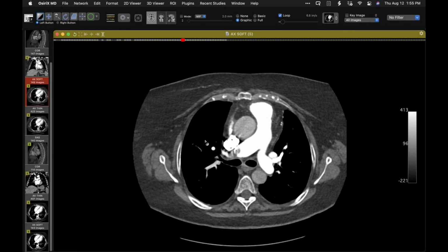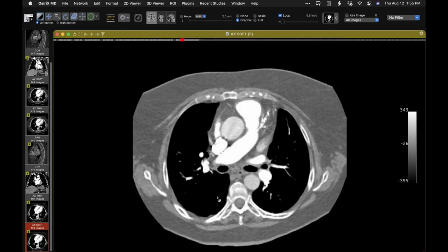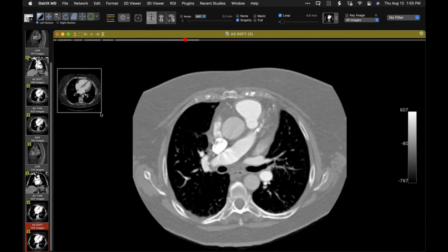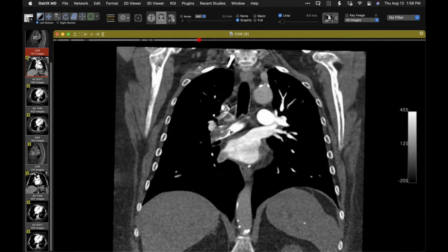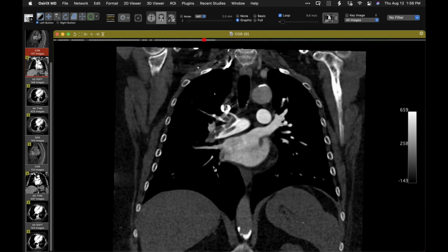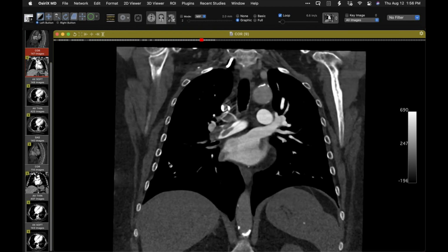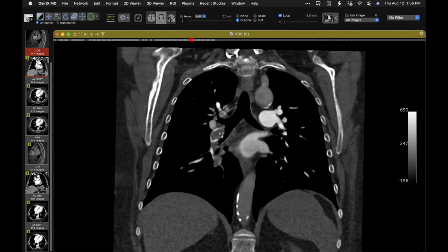So this to me is interesting, because usually the clots are just much more discrete without those kind of apparent scalloped edges to it, or lobulated, however you might want to describe that. Let me show the coronal actually as well. So this is the initial one. And yes, there's streak artifact there, but this really bothered me for possible sarcoma, even though it wasn't really mass-like. But just to confirm, that went away entirely. And on an ultrasound that was done after I saw the CT, there was a little clot in the popliteal vein on one side. So maybe the rest of the clot all ended up there.